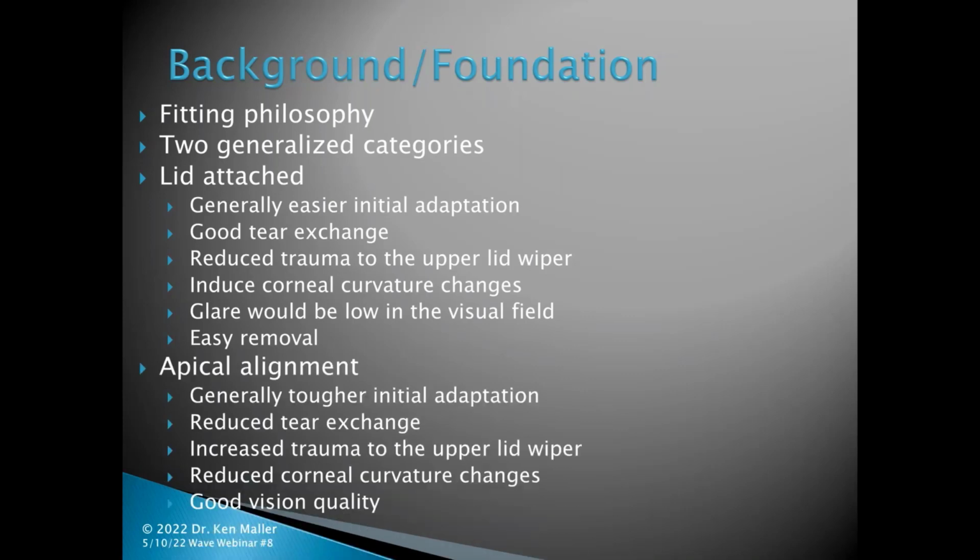The other camp was really apical alignment, where they would generally fit a little bit steeper.